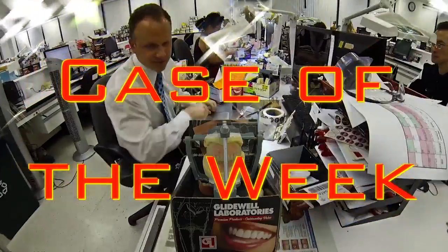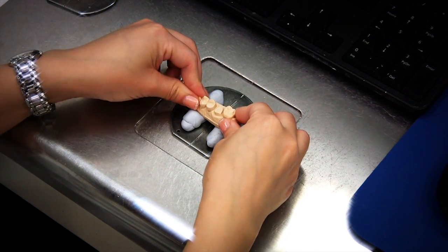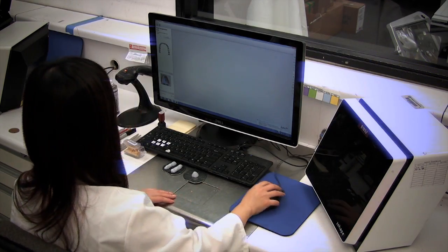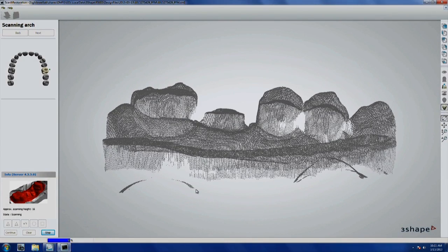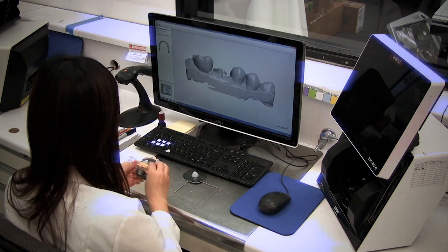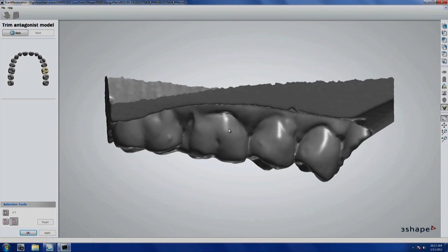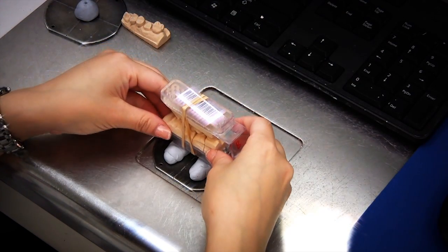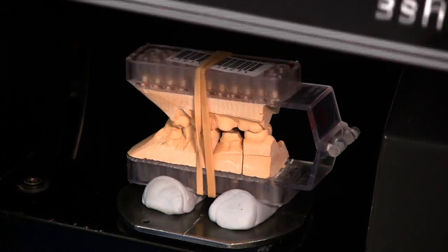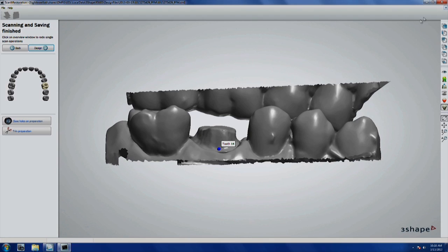Here's the production of a Bruxer crown from start to finish. The dentist sent a polyvinyl siloxane impression, so we poured it up in stone. You can see the stone model of the prep arch being put into a 3Shape scanner — we want to get it into the digital environment as quickly as possible because everything is more consistent digitally. If the dentist had sent a digital impression we'd start from that, but with a conventional impression we have to pour and scan. We can also scan the articulated model from the side to see exactly how much reduction exists between the prep tooth and the opposing tooth.